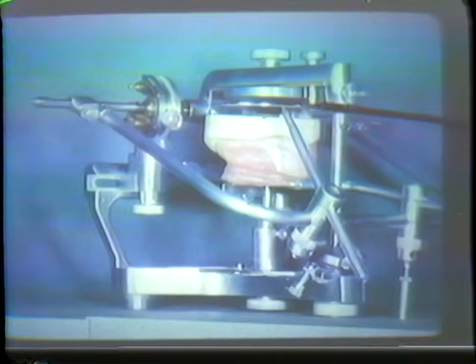Another way now is to use the third point orientation. This is the orbital as used in the Hanau technique. We have an axis, a point. This now becomes a reference plane to which to mount on an instrument, as shown here. It's automatically incorporated in the design of the instrument, and we have the pointer go up to this position so that we have somewhat the same relationship now of the maxilla to the transverse or the horizontal axis.